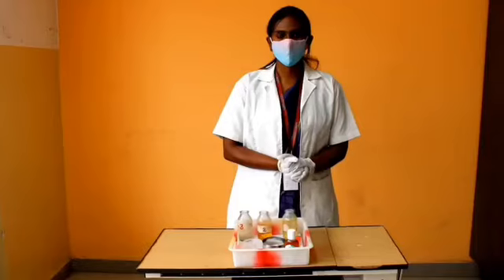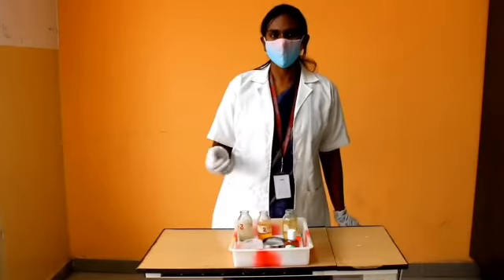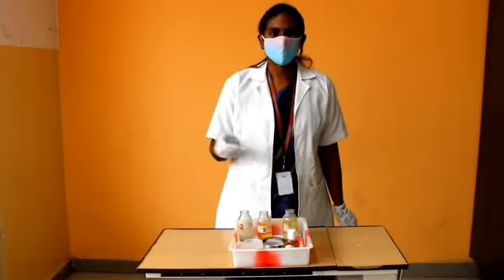Good morning everyone. In this video we will be demonstrating the vital signs procedure. Vital signs are a group of four to six most important medical signs that indicate the status of the body's vital functions.